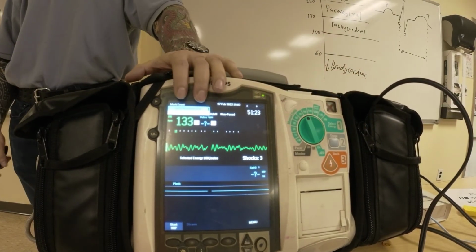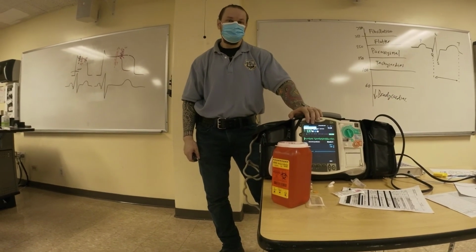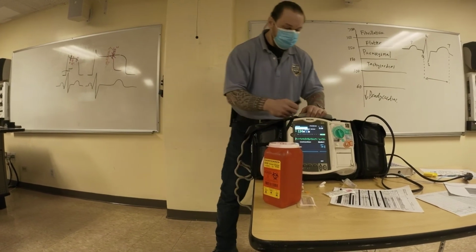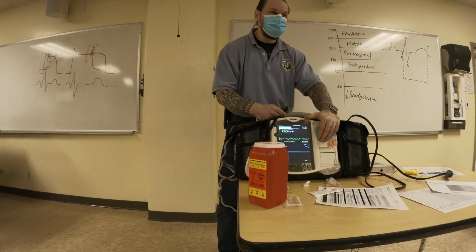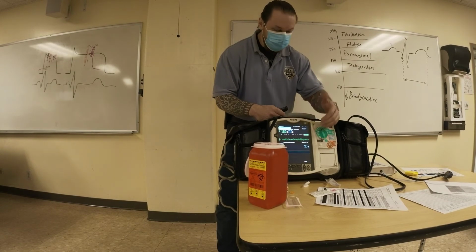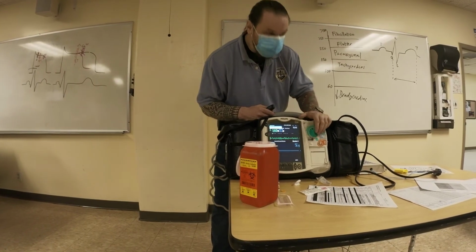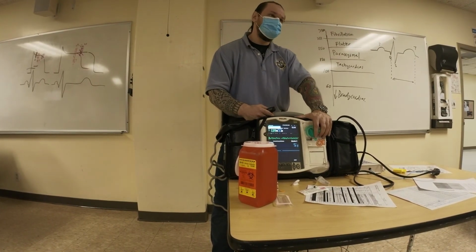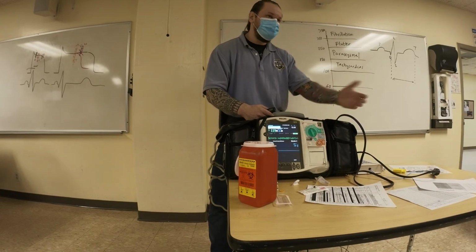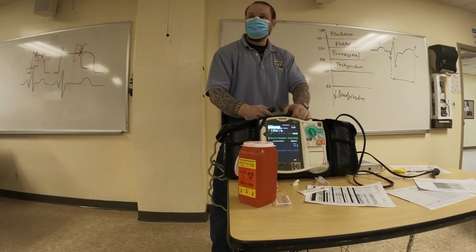I have a question. If you're giving it unsynchronized, that's not a separate thing? You don't need to call medical control? You can just do it. Yeah, because you're trying to give them the electrical therapy. They're unstable, but because the machine is not sensing the R wave, you're unable to deliver any energy. So at that point, you have no choice to give unsynchronized, because this person is already unstable. You continue doing this, they are going to be in cardiac arrest, or they already are. You're just not sure yet. Anything else?